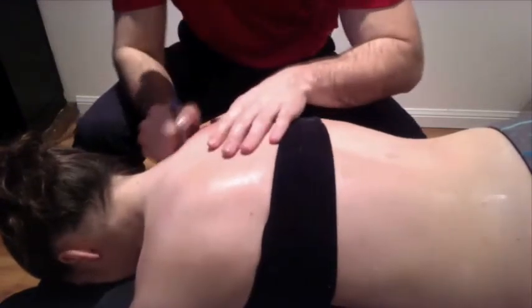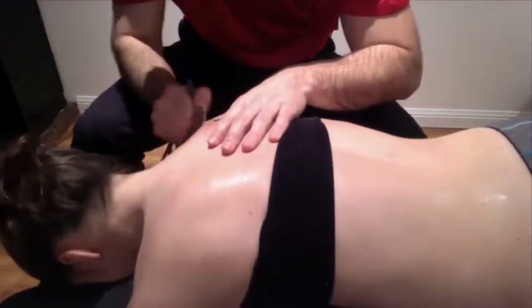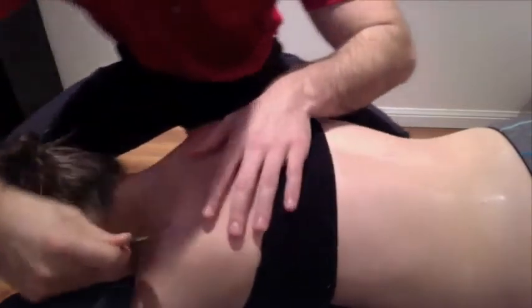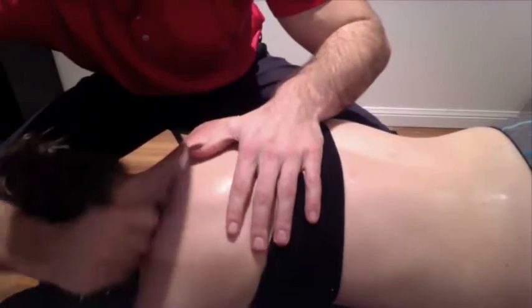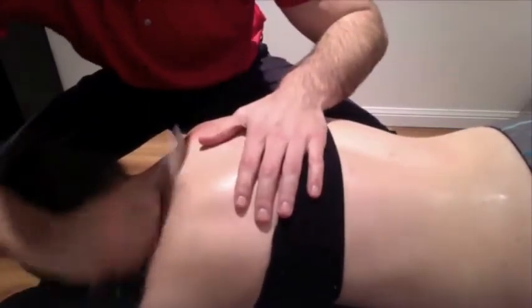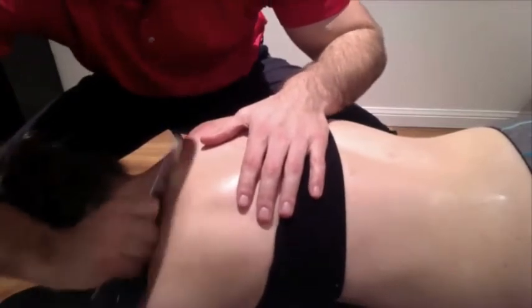Still using that 35-degree angle, and right up into where it's attaching into the C-spine. For the sake of the video, I'm just going to reach across and treat the other side as well. I enjoy pushing away from me doing the traps a little bit more, so I ideally would be on the other side, but this works just fine.